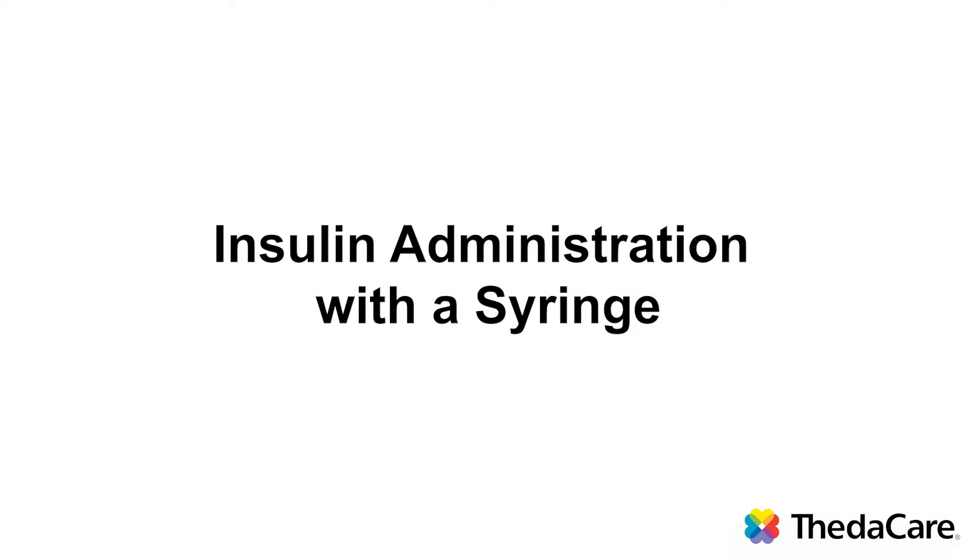Hi, my name is Joyce Graves, Diabetes Educator with ThetaCare. The topic of this video is to show you how to draw up and inject insulin using a vial and a syringe.